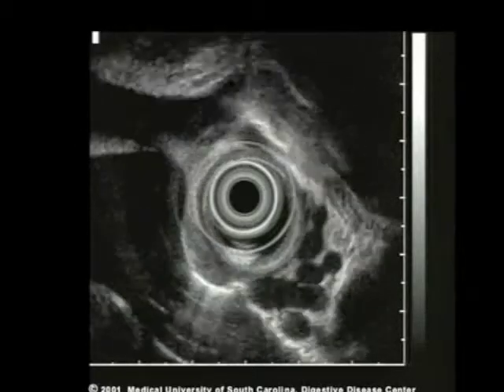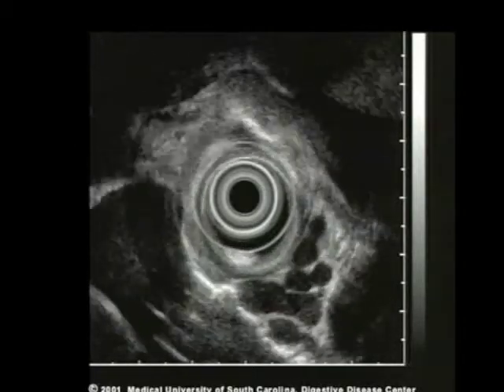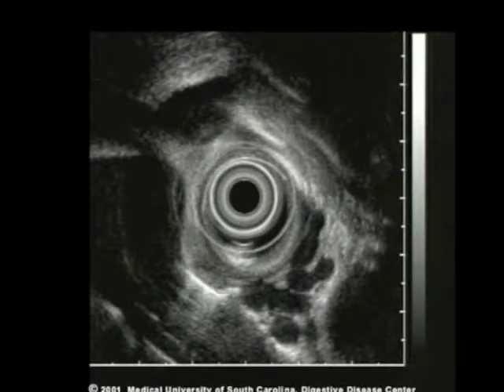Again, esophageal varices are very easily identified with the EUS scope, sometimes in the absence of endoscopically visible varices.